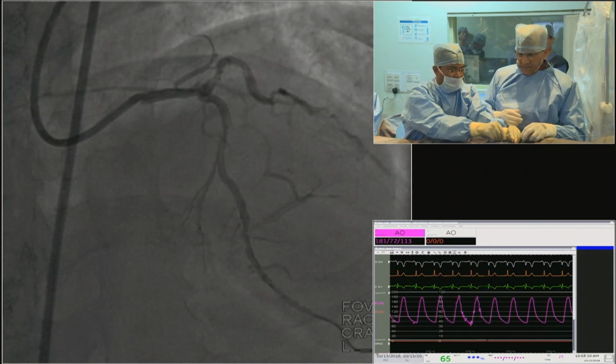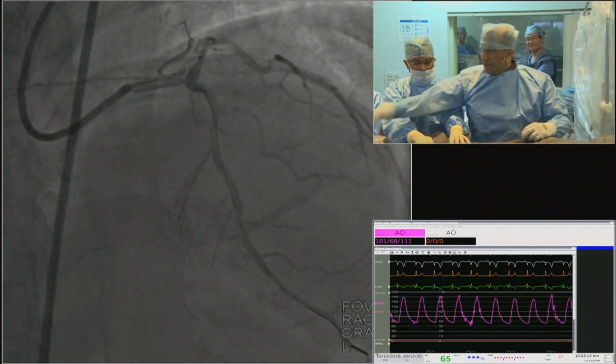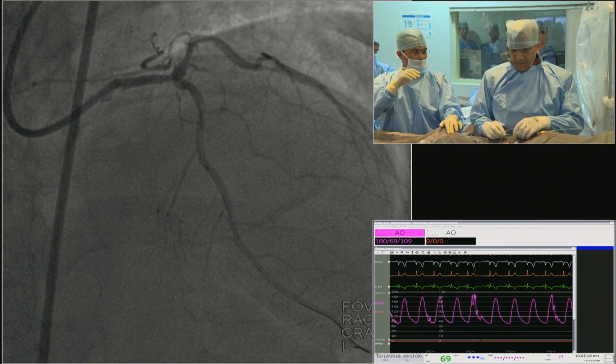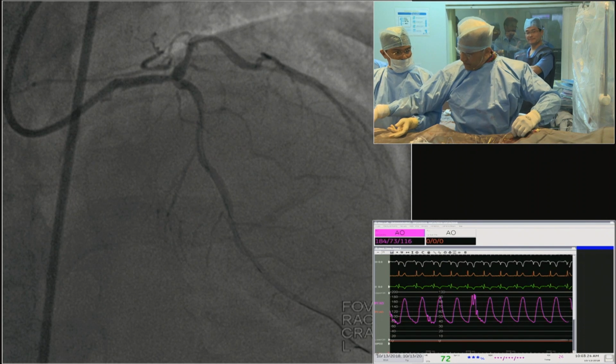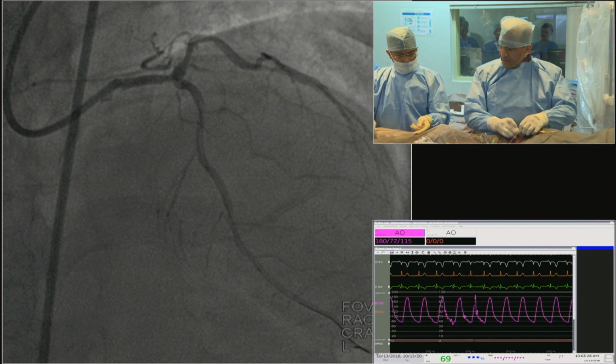Yeah, that's all right. Well, Anil, both concepts are okay, but the proximal stent in this case I would put first, simply because in this case my landing zone millimeter to millimeter is more important to me. Exactly. So there's nothing wrong or right about it. No, I agree. I agree, but thank you for saying this and not raising your hand.